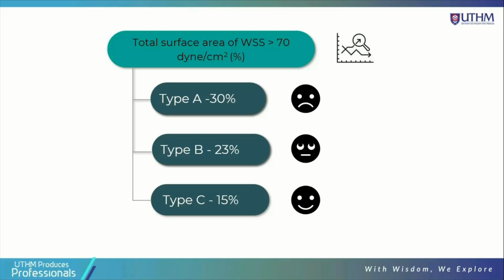The development of the stenosis process is influenced by the direction of flow passing through the sheet of the stent strut configuration. The main factors that influence the growth of stenosis are thrombosis and atherosclerosis. The formation of thrombosis and atherosclerosis can be predicted numerically based on hemodynamic factors. A wall shear stress value greater than 70 dynes could lead to the formation of thrombosis.